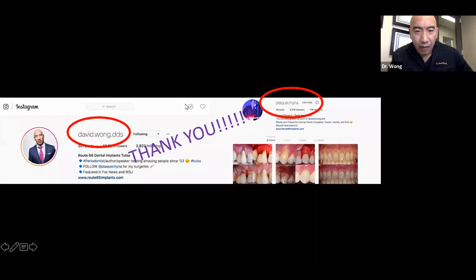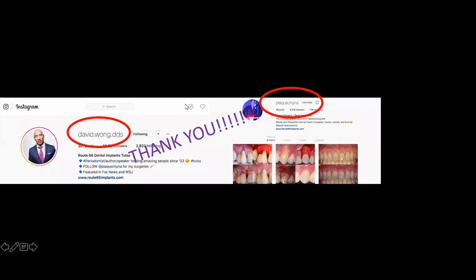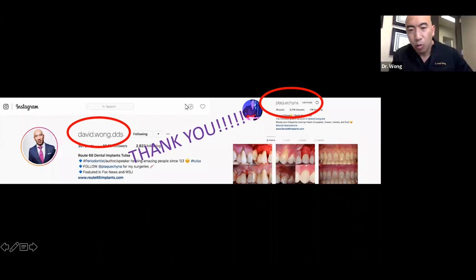So let's see. I've got a question about Ossix Plus. Ossix comes as a grafting material as well as a membrane. You can't use the Ossix Plus membrane for the ice cream cone because it tears too easily. As soon as you touch it or try to manipulate it or even push on it, you'll rip a hole in it. As far as the grafting material goes, I'm assuming we're talking about Ossix bone. Good grafting material, probably just a little unnecessary for the expense of it. But it is very practical. It's just that the cube is so small, you can't do a whole lot with it unless you buy the bigger cube, which is going to cost you a little bit more money that you don't really need.